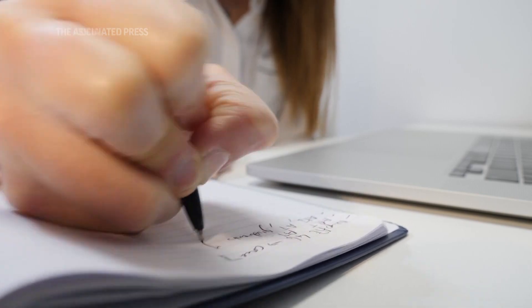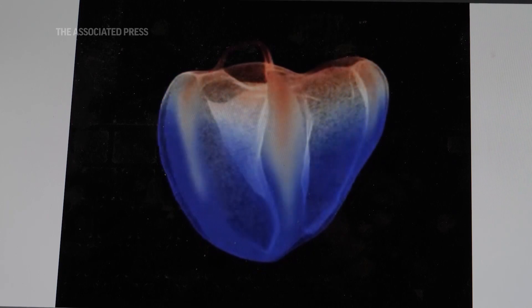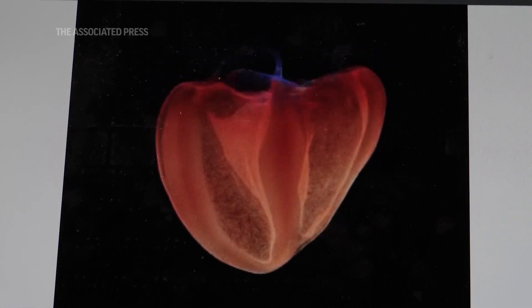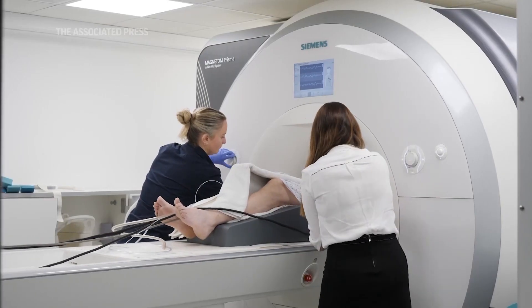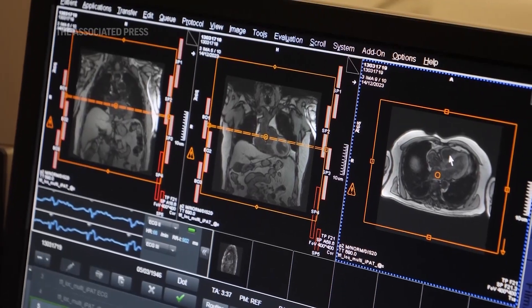Not as a single signal, but mapping the heart panoramically, so we literally get three-dimensional maps of the heart, and we can look at the electrics of the heart propagating all across the cardiac chambers. And then when the patient goes in to have their MRI scan, at the end of the scan, we are able to map that data onto the MRI scan.